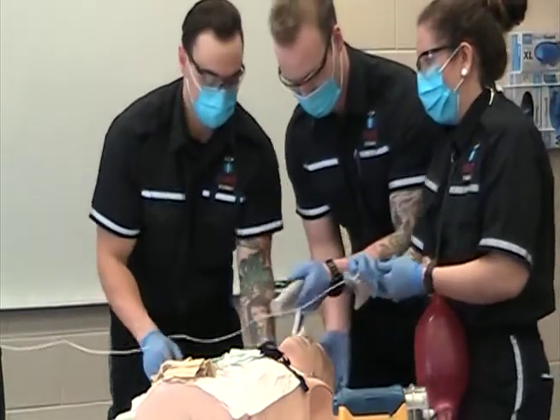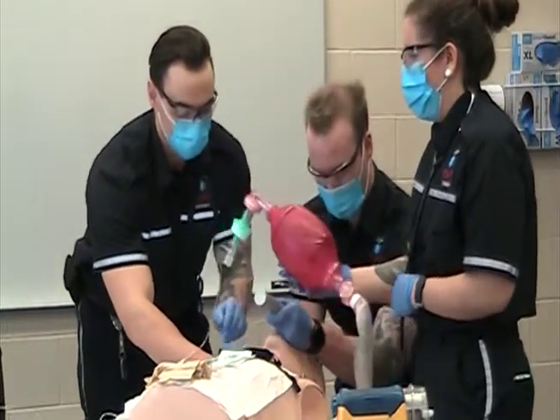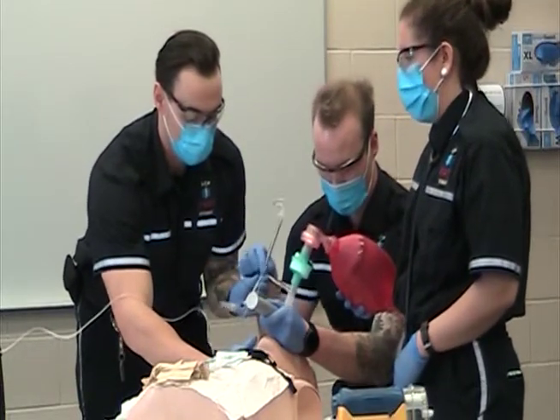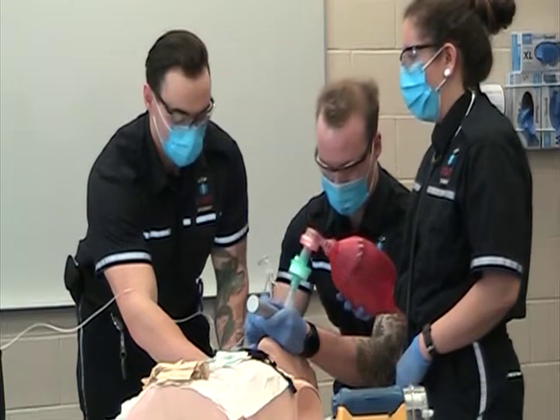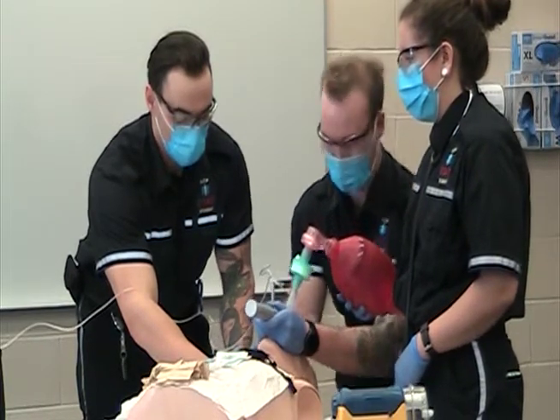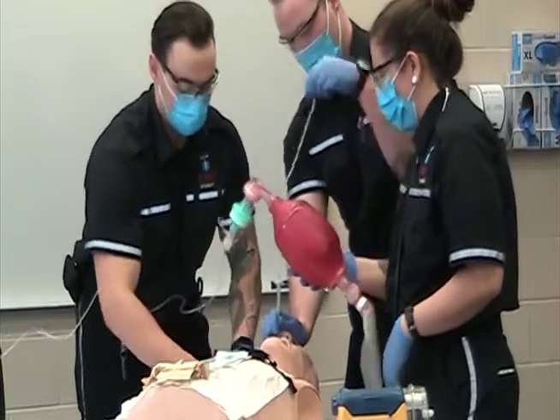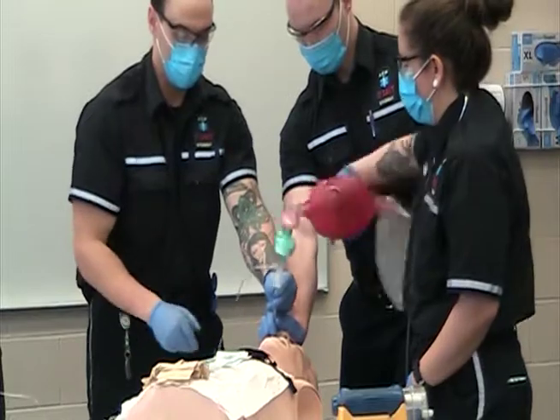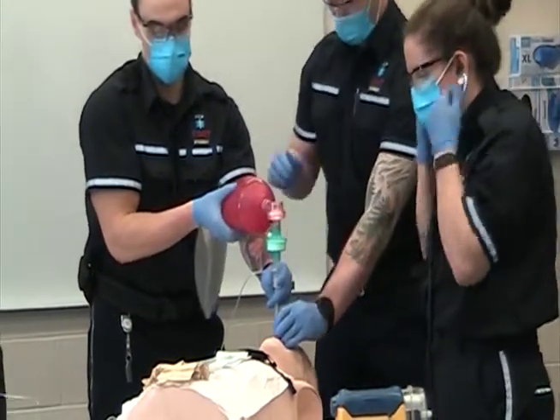1, 2, 3, 4, 5, 6, 7, 8, 9, 10. I can see the tube going through the cords. 11, 12, 22 at the teeth. 13, 14, 15, 16, 17, 18, 19. So I can bag, Rob.